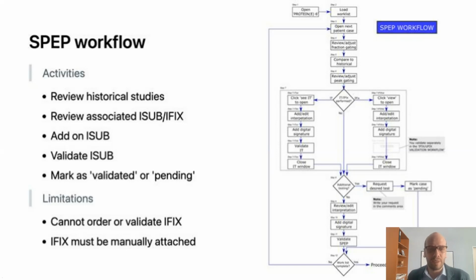One additional problem we've run into here is that the immunofixation images, these are scanned images of physical gels, have to be manually attached. And so we just had to reinforce with the technologist how important it was that they reliably attach those images so that we would have them associated with the studies, both for the interpretation today, as well as if we need to look back in the future.